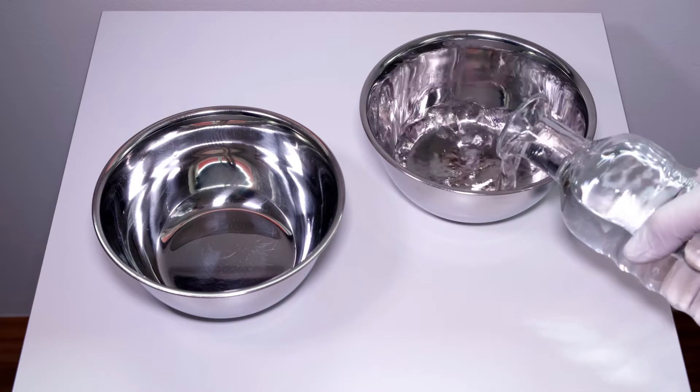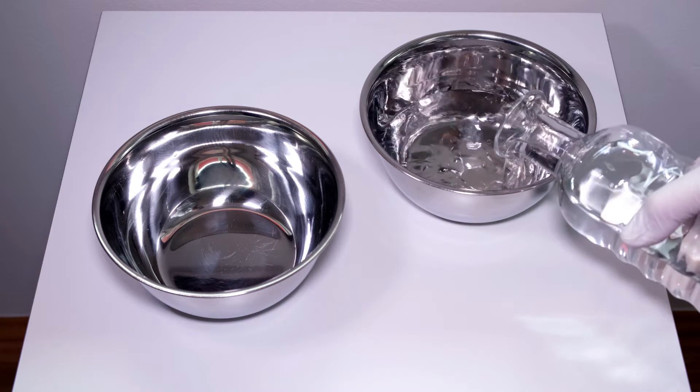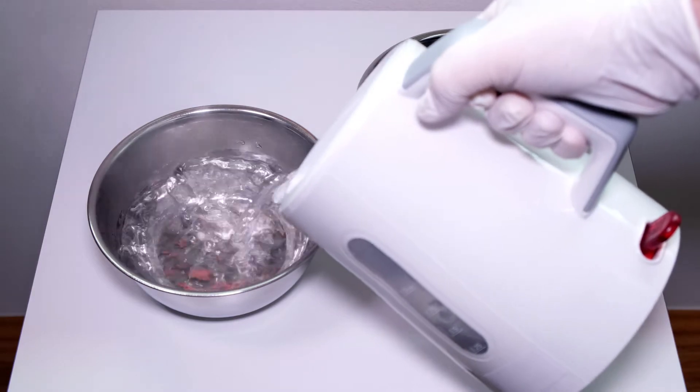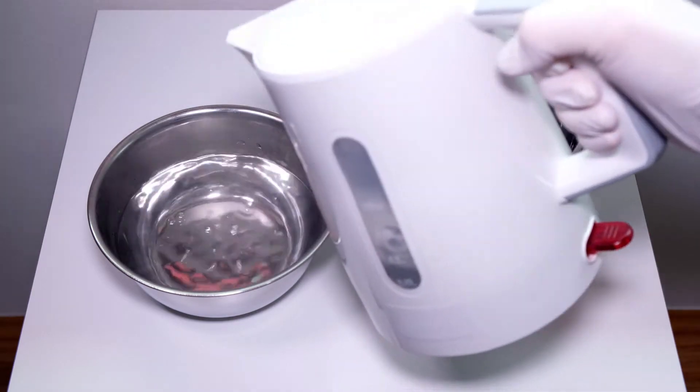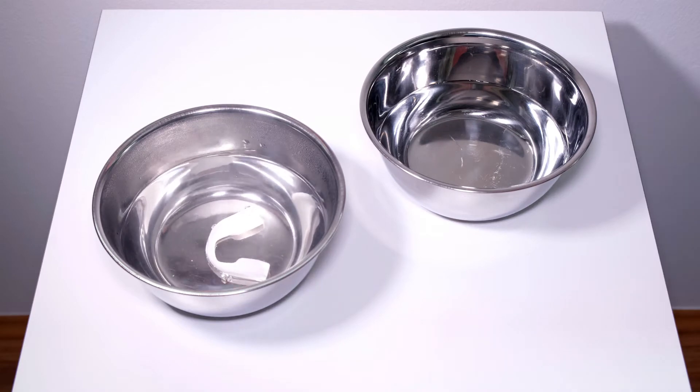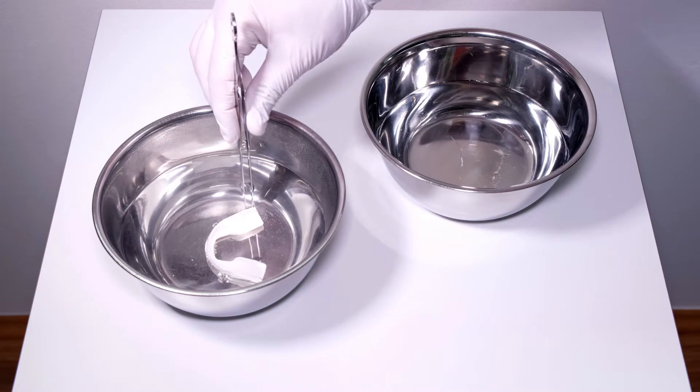Have the two small bowls ready. Fill one with very cold water. In addition, boil some water in a kettle or saucepan and pour it into the second bowl. With the hard outer tray facing downwards, put one of the trays in the hot water bowl for about 60 seconds.